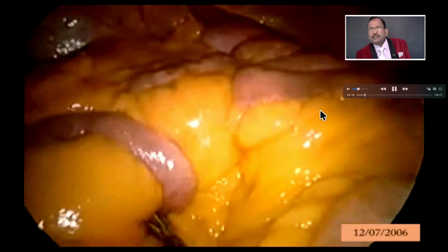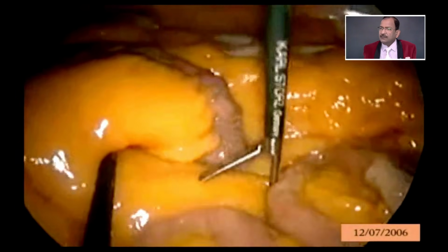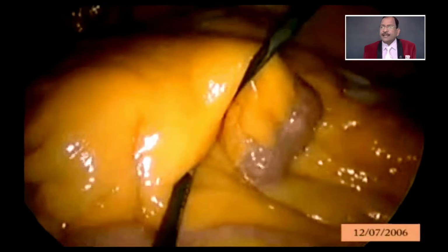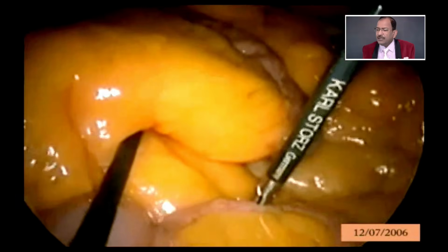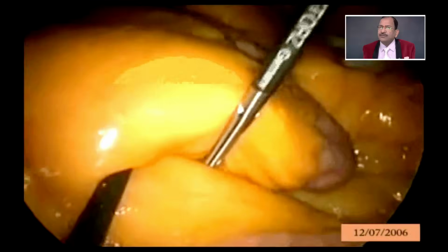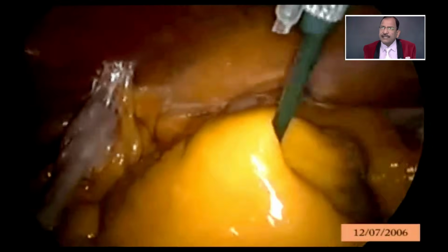When you pull all the small bowel, you should be careful that it should not have a torsion at the level of the mesentery. So haphazardly you should not pull; carefully you should pull, taking care that the root of the mesentery does not get twisted. Otherwise another problem will start. It is pulled carefully towards the upper abdomen, and above the transverse colon you will drop it. If the patient's bowel is empty, then it is easy. If the patient's bowel is distended, then it is difficult.